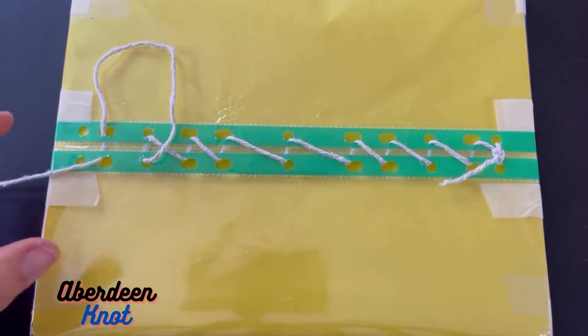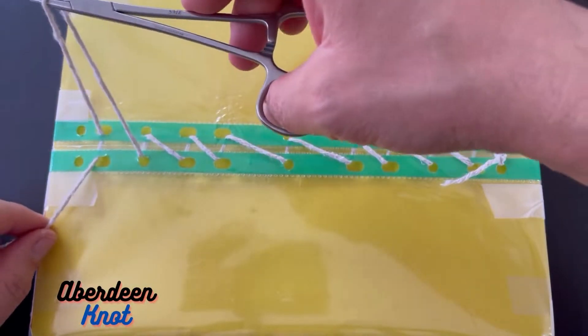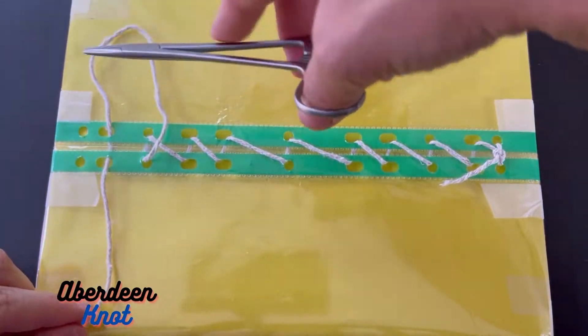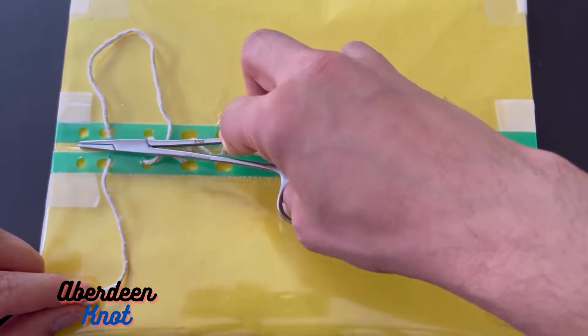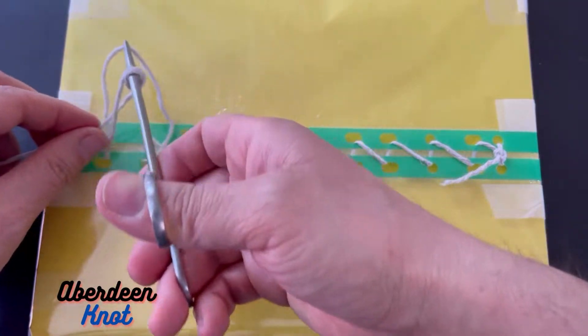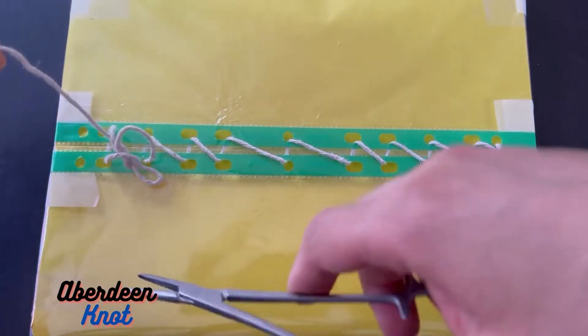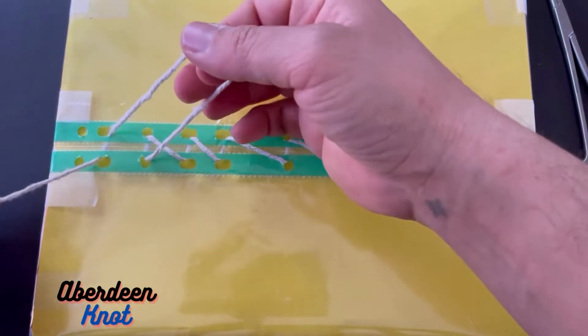This is a continuous stitch and we'll try to tie it in a slightly different way. The first way of tying it is just using a simple stitch with the needle holder — put the needle holder in the middle, two throws, hold the other end, pull through and so on. But that's not how we are going to do it now. This time we are going to use something called the Aberdeen knot.